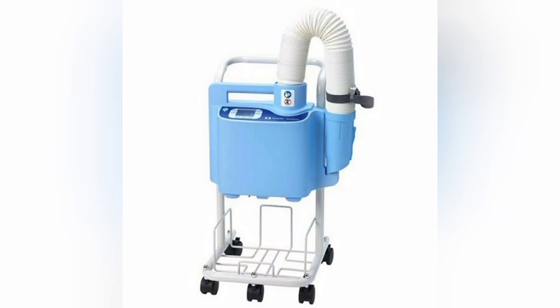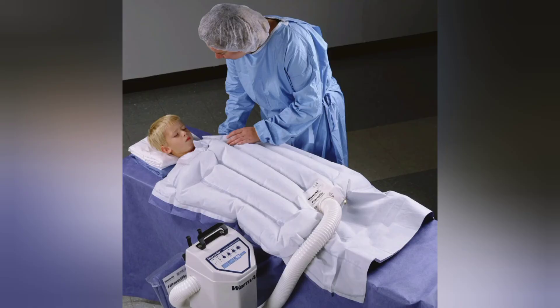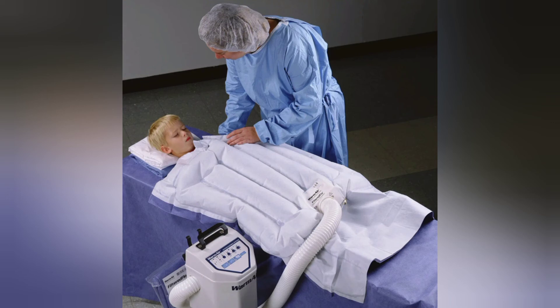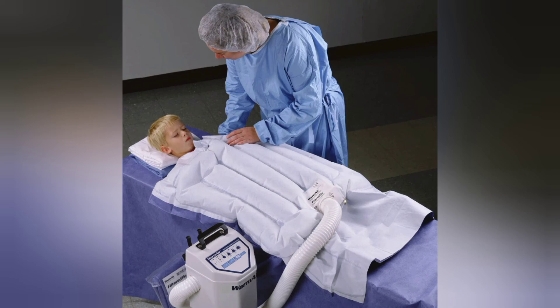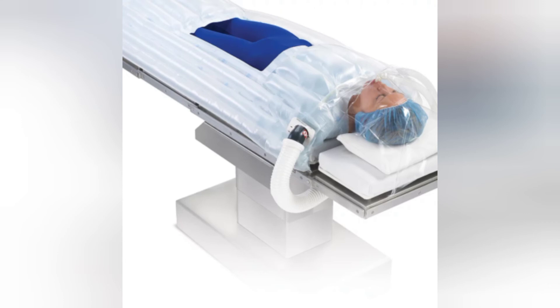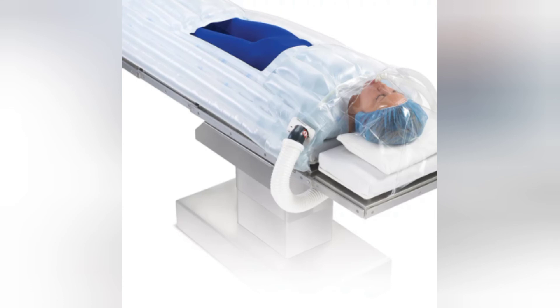The next equipment is the patient warmer. In the operation theater, to reduce the risk of infection, it is recommended to keep the temperature below 20 to 22 degrees Celsius, which may affect the patient's health. To provide warmth to the patient, a patient warmer is applied. The patient warmer comes in the form of a blanket in which warm air up to 45 degrees Celsius can be filled. One can set a specific temperature to fill the warm air in the blanket, and the patient is covered with the blanket except over the surgery area.